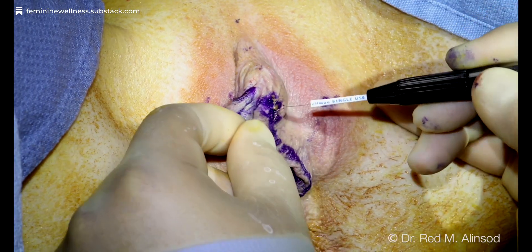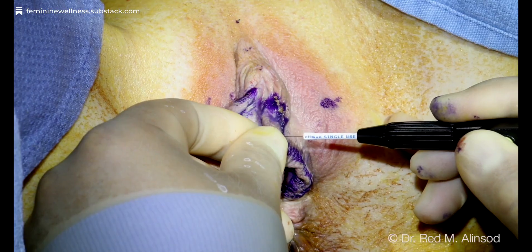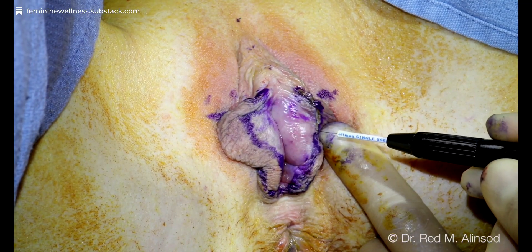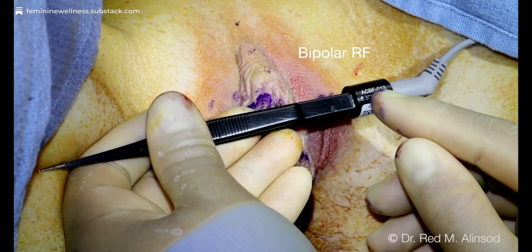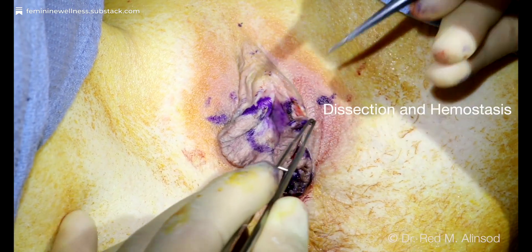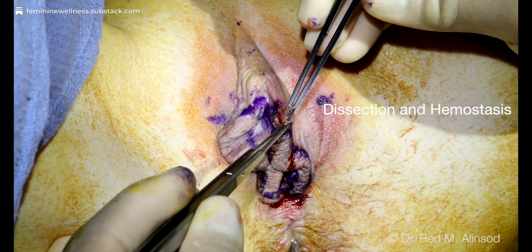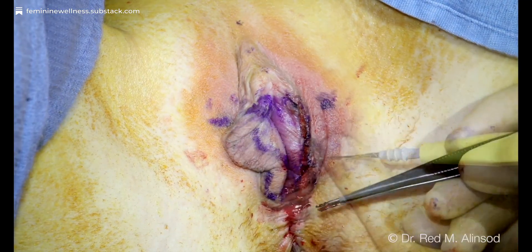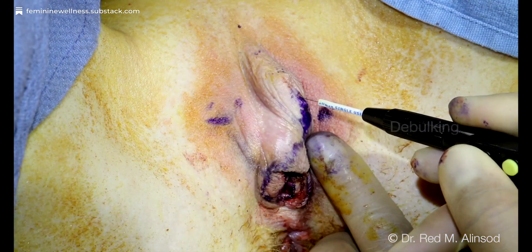I can use this for my standard labiaplasty, where I leave more tissue, or I can use this for my Barbie look labiaplasty. You can see how precise this is and how the lateral thermal spread is minimal, both on the lateral and medial aspects. Now, this is not very good with hemostasis, so you will need standard cautery, or pull out this bipolar radiofrequency device. This device has about a one millimeter tip, able to dissect tissues quite precisely. You hold tissues very softly, press your foot pedal down, and it cauterizes with a bipolar technique. I always use my standard cautery as backup in case I have bleeding.